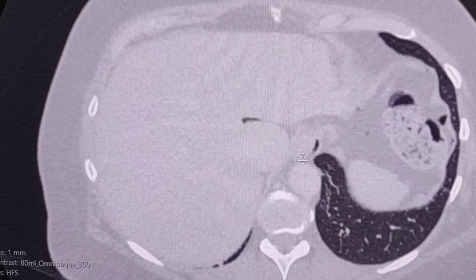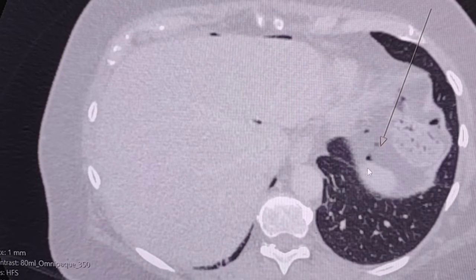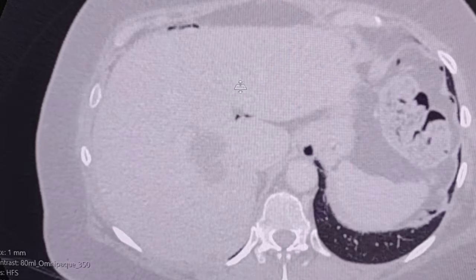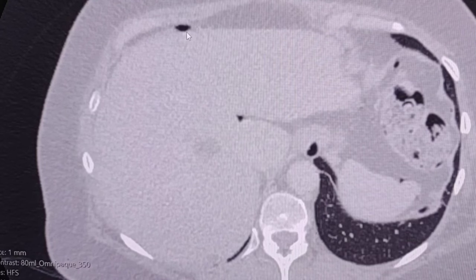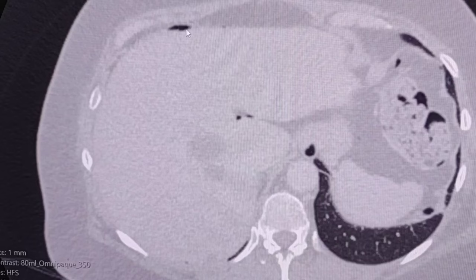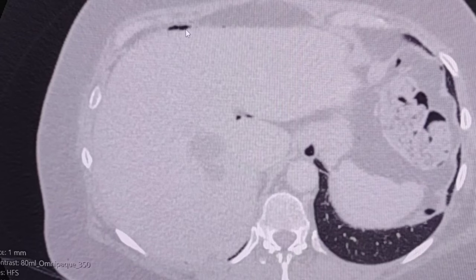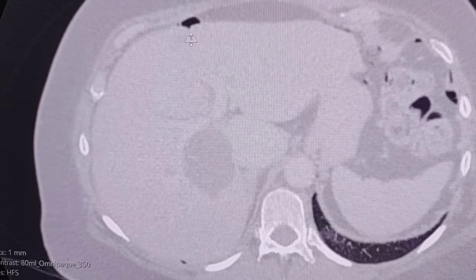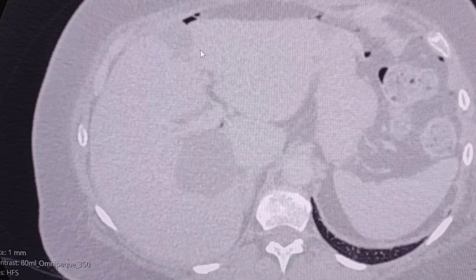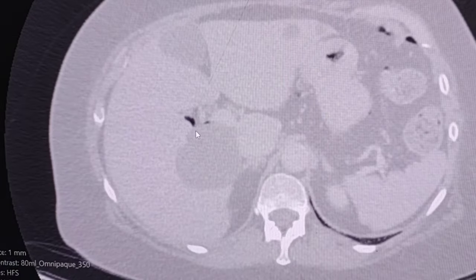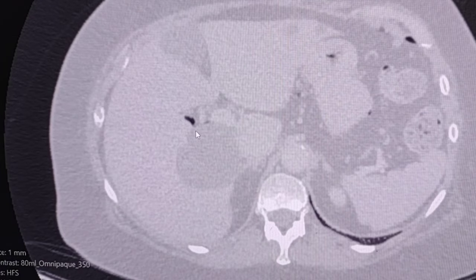Free air in the abdomen, even after an operation, could be caused by accidental injury to the gastrointestinal tract, so close follow-up is recommended. So free air in the abdomen is noted.